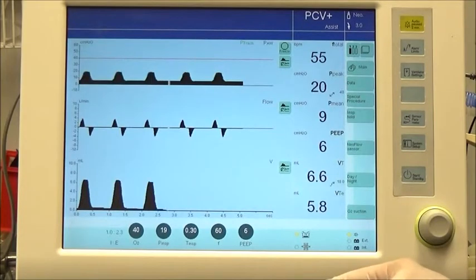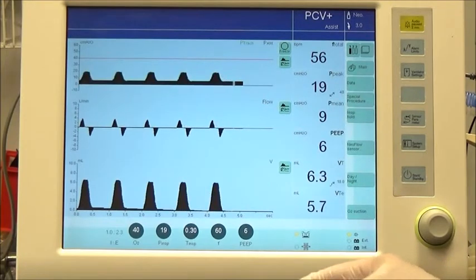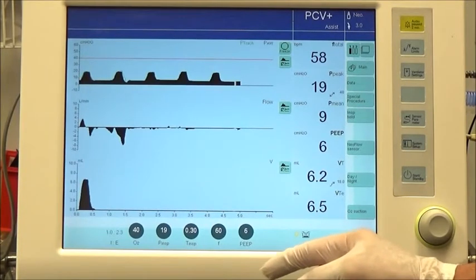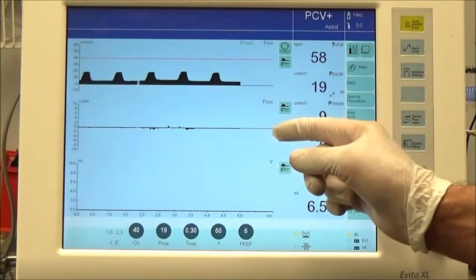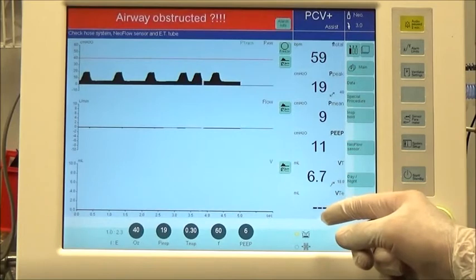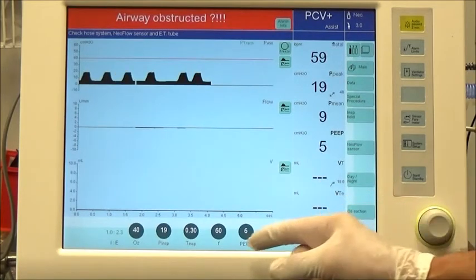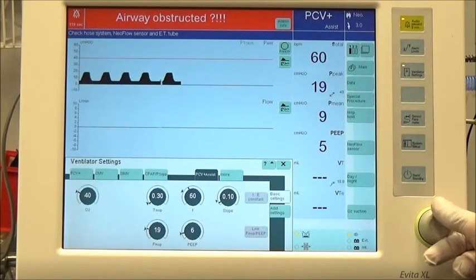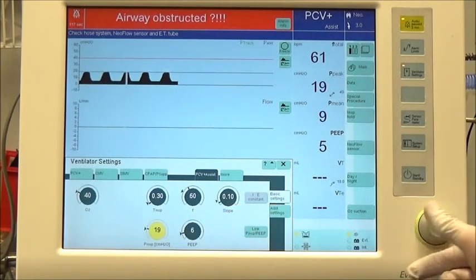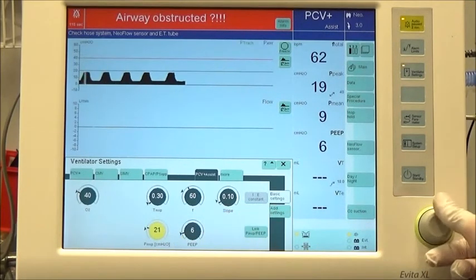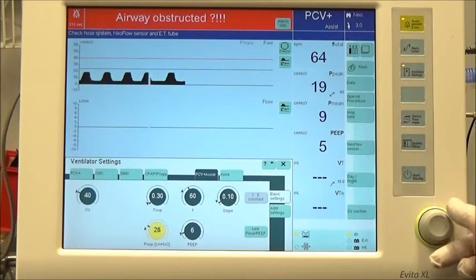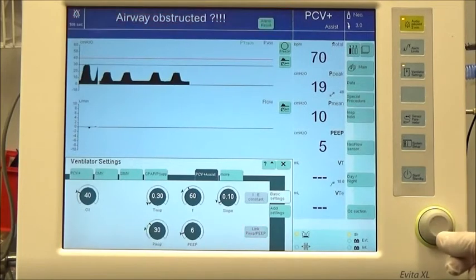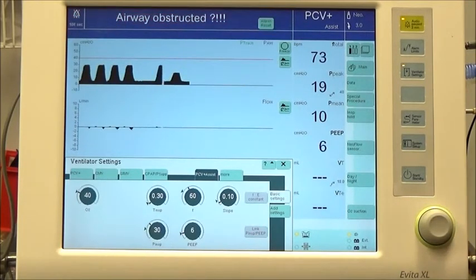As surfactant is administered, watch the ventilator flow waveform and tidal volume to determine ventilation. If ventilation is limited — as observed with minimal flow on the ventilator graph and/or less than expected tidal volume delivery — after the MAC catheter is withdrawn from the endotracheal tube, increase the set PIP to 30 cm of water pressure and assess over 15 seconds.